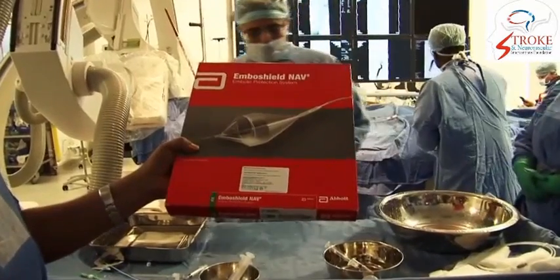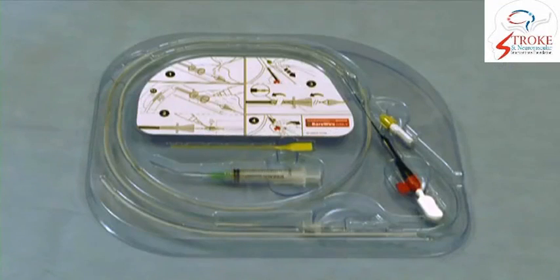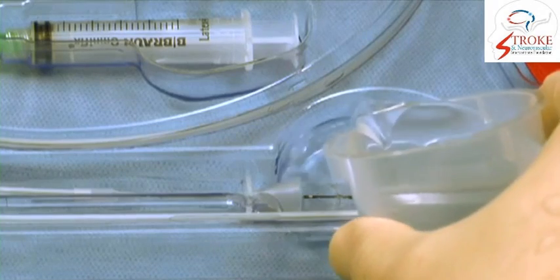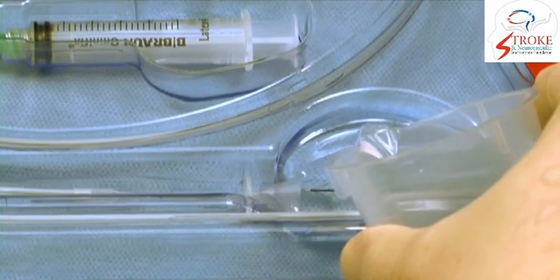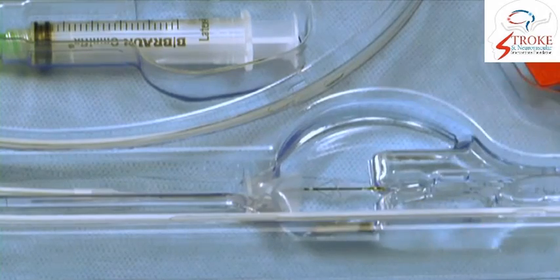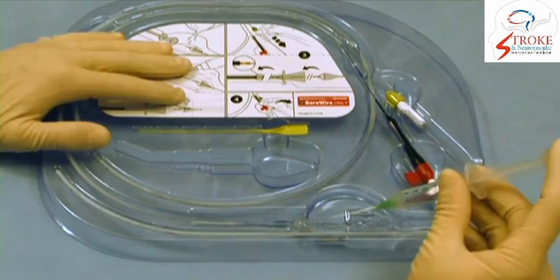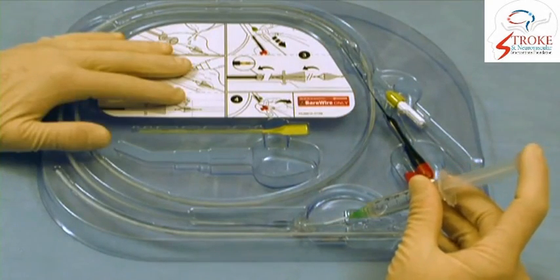The filter device is being taken. Preparation of the filter device. Heparinized saline is being used to fill the pot in the tray. Then the syringe which is given along with the device is being used to flush the filter and the catheter.